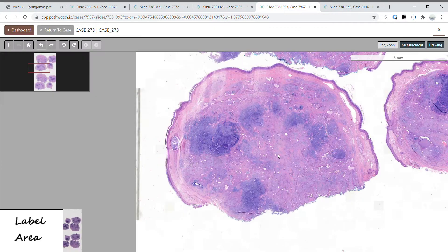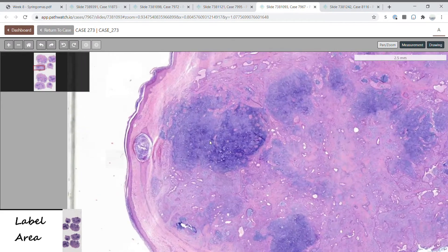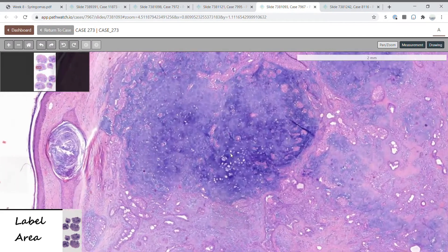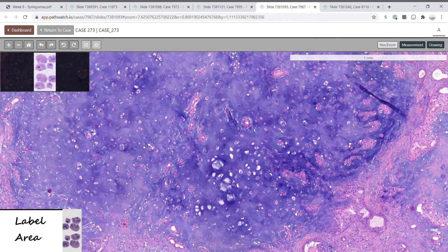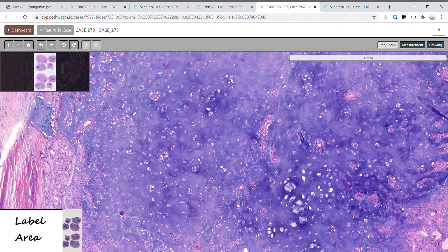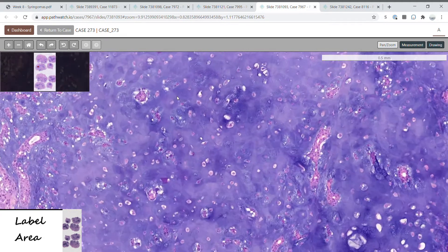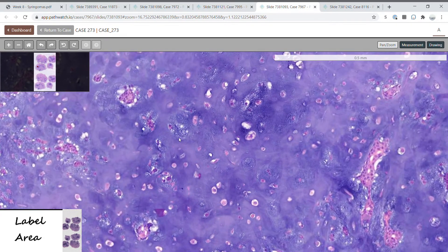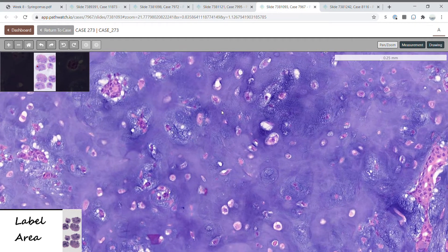Yet another mixed tumor here. I want you to note this blue area — this is where the chondroid phenotype of chondroid syringomas comes from. This is immature cartilage with a bubbly blue matrix as well as floating chondrocytes.